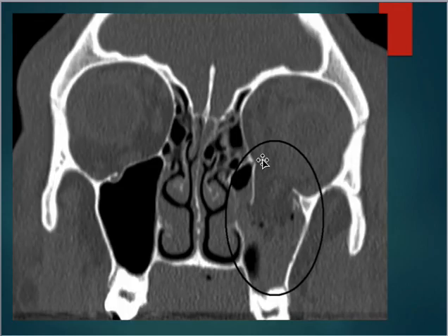This is an orbital fracture. So over here, this is nice and intact. So you've got the orbit here, you've got the black, which is the air in the sinuses. Right here, you can see the fracture. And then you can see how the fluid has actually filled the entire sinuses, other than this little area right here.